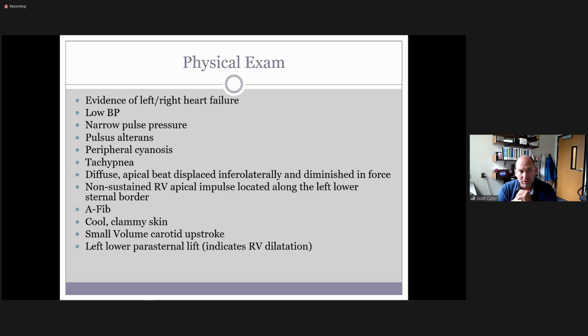And what she said was that the doctors tell them not to try to tweak the results, because as she uses the strain imaging, it'll start to show things that are abnormal, and a lot of techs will try to make that fit the normal pattern and adjust it so that it tells them what they want it to tell them.